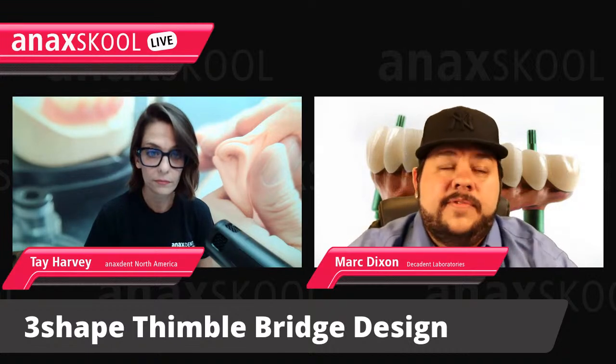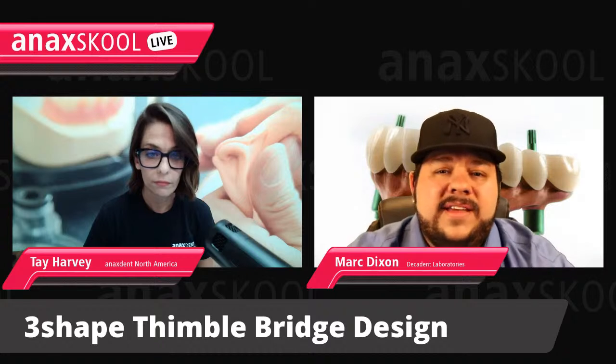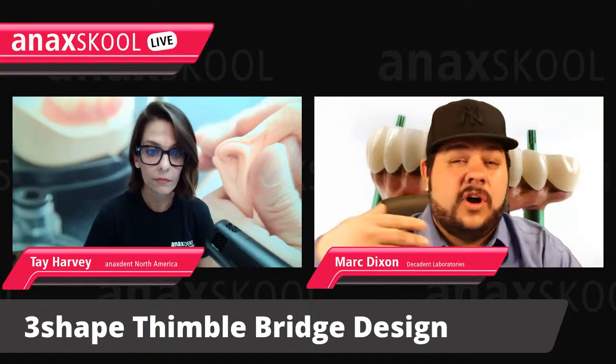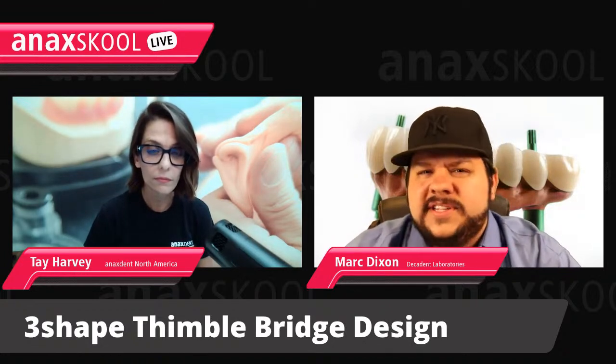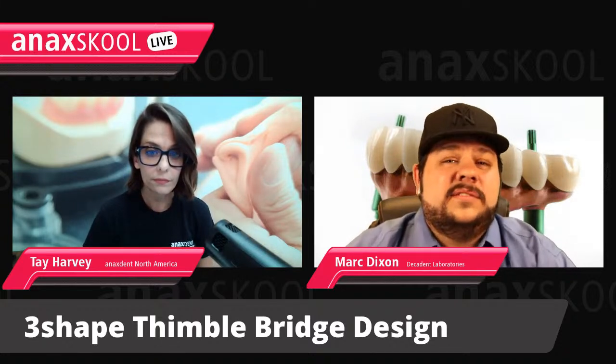And chances are, if you're lucky, everything was planned surgically and you have a diagnostic wax-up pattern set in stone already to get started with once you get the case. But that's just not always the case.